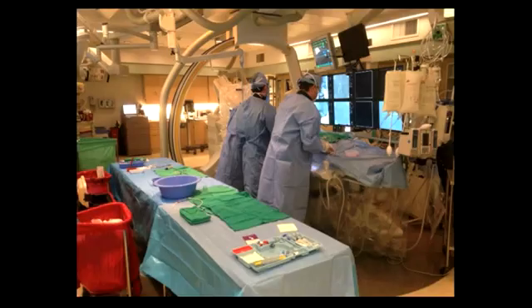This is a picture from the operating room setup from this case, where you can see it's a sterile table setup with a second table on the side where we drop the embolic agent and usually change our gloves when we drop the embolic agent for the embolization. We have the anesthesia setup behind the biplane monitors, AP views.